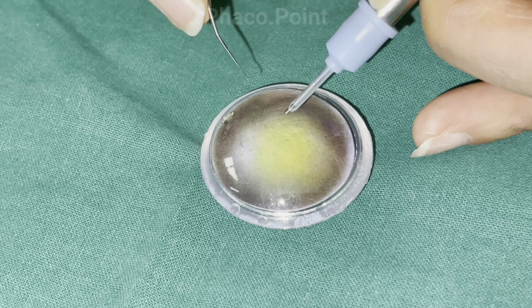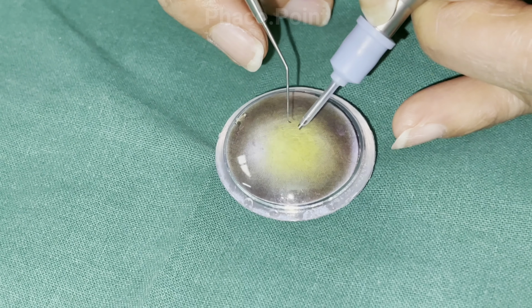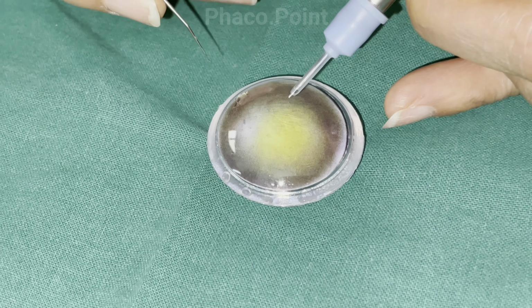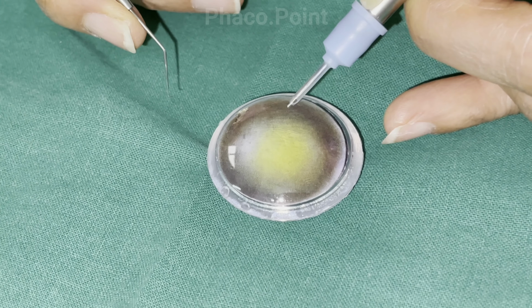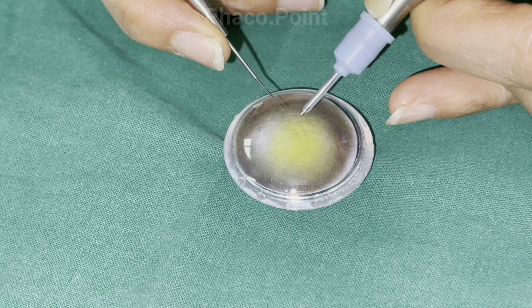Now, for fragment removal, the foot pedal control is as follows. Let's assume this is a pie-shaped fragment. What would be your foot pedal control to remove it? You're still now in foot pedal 1. Always stay in foot pedal 1 when you're doing nothing. Because if you were to go to foot pedal 2, you're going to hold on to things like your pupil, your rhexis edge, and create intraocular damage. So always remain in foot pedal 1.